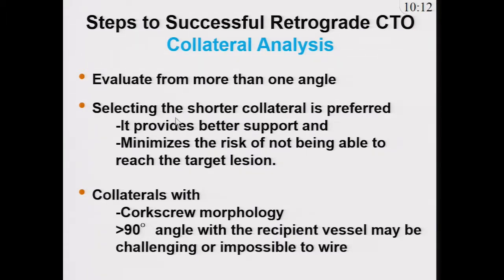The other point is you are supposed to be using the shorter collateral. However, you have to look at the whole diagram of the collateral, so you need to understand where that septal collateral will end up, because that will tell you which collateral you are supposed to use. Even if the shorter collateral gives you better support, it is not necessarily the one that is going to get you to the final point.